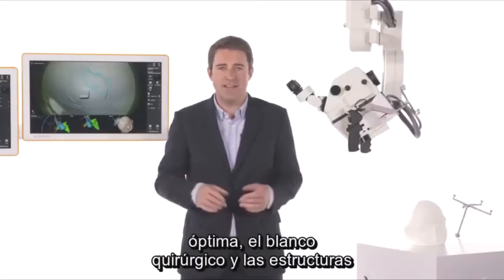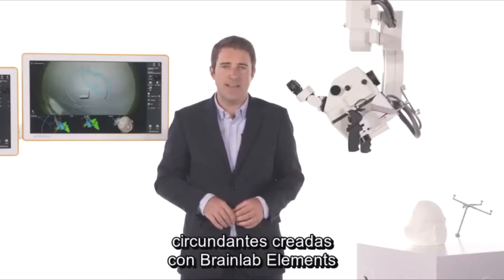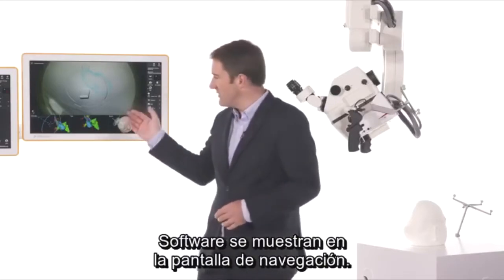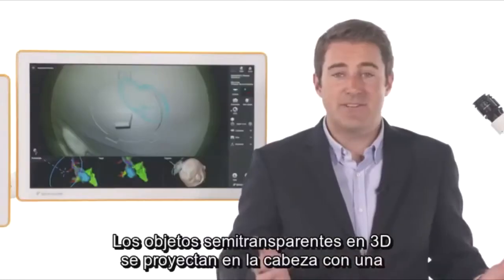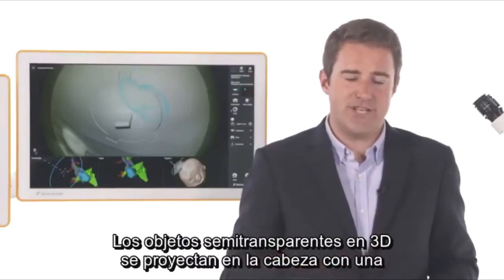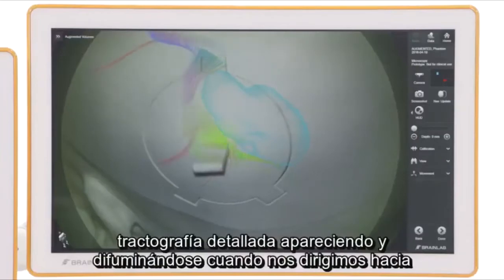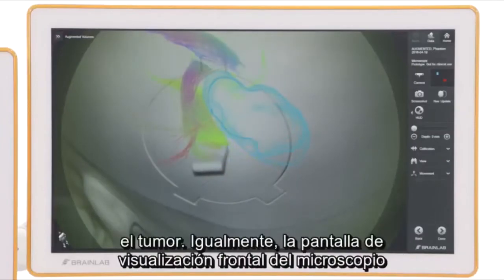the surgical target and surrounding structures created with BrainLab Elements software are displayed on the navigation screen. Semi-transparent 3D objects are projected inside the head with detailed tractography, fading in and out when proceeding toward the tumor.